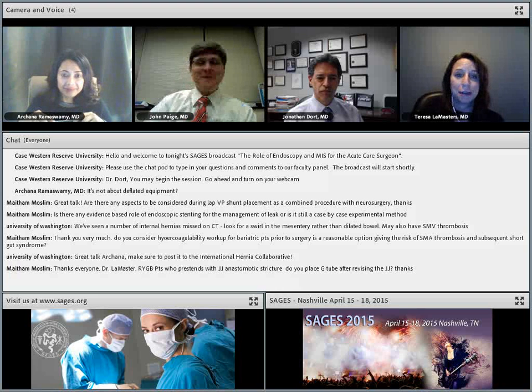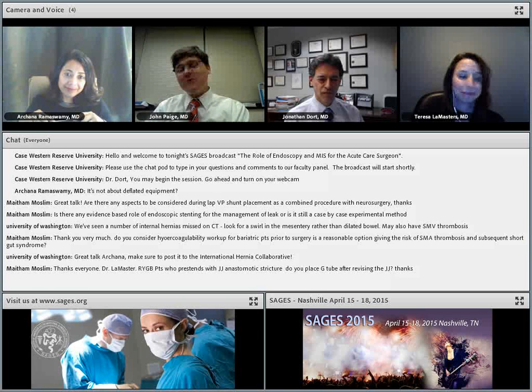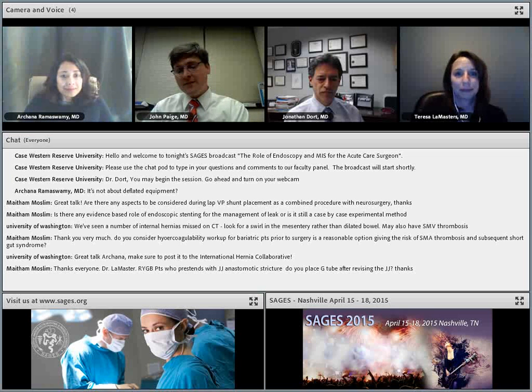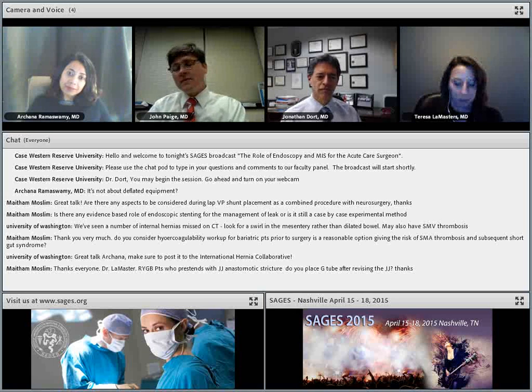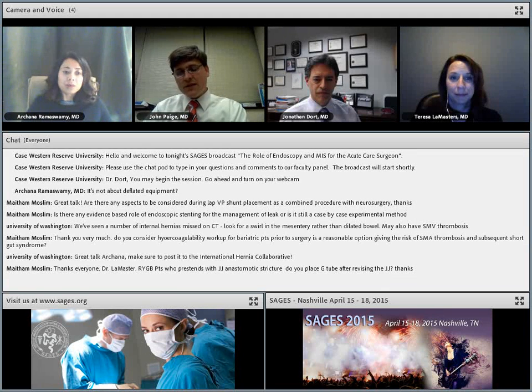If they're a bariatric patient, I will go laparoscopic all the way, and we'll stick to it. Because if they have a retrocolic hernia or a Peterson defect or something, I think laparoscopic is definitely the benefit in that situation. It's a different situation. I also agree, as Jonathan was saying, if you think it's just a small adhesion, then yeah, I usually look laparoscopically, and those are the high success rates.